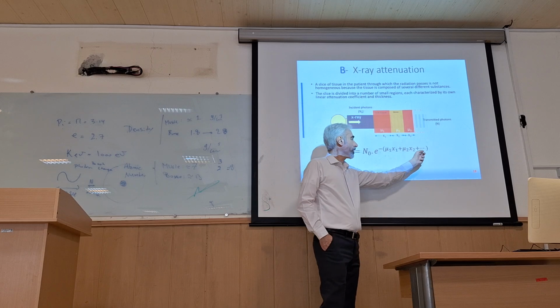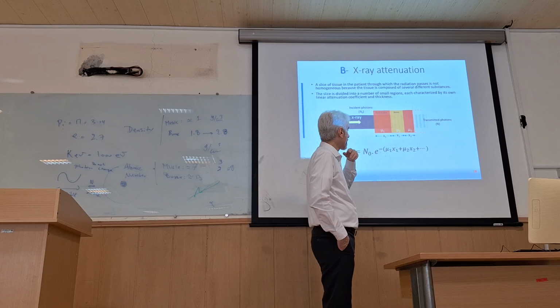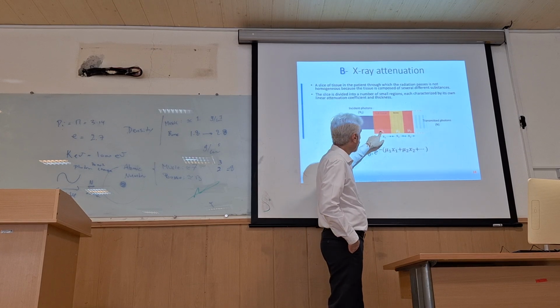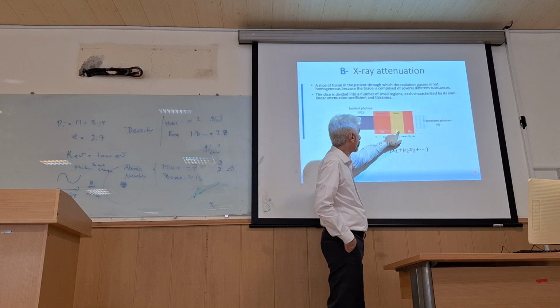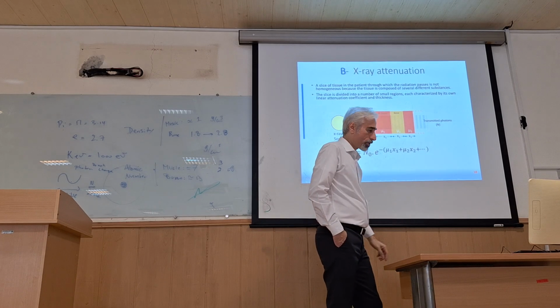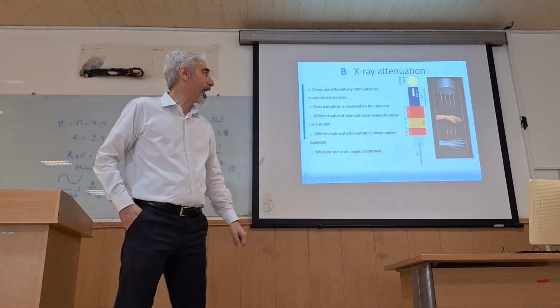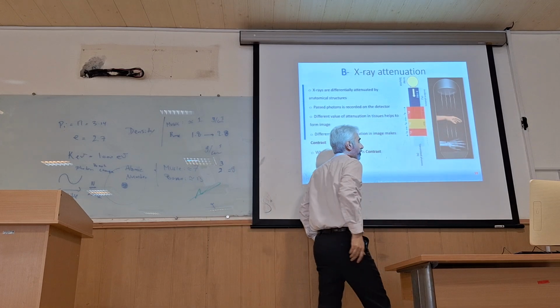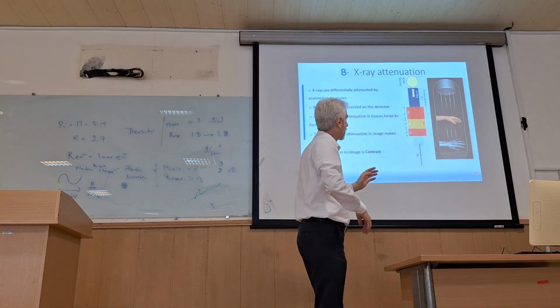Here, the attenuation value and the thickness value should be changed slightly by such a formula. For example, mu1 by x1 plus mu2 by x2, plus mu3 by x3, and so on. So, the first picture that we started this course with, the X-ray source, the body and the detector, we can somehow simulate by this sketch.